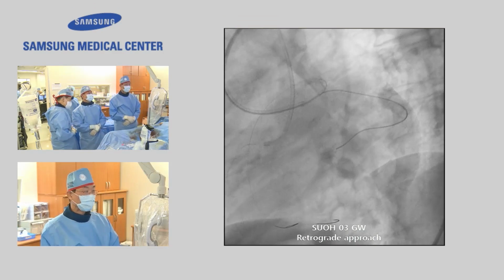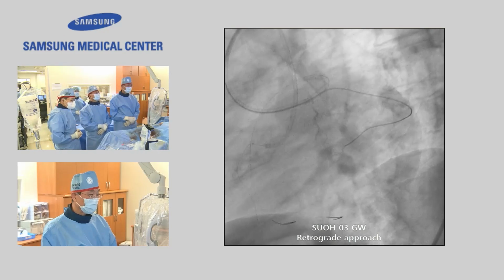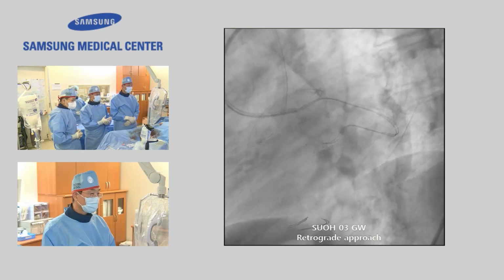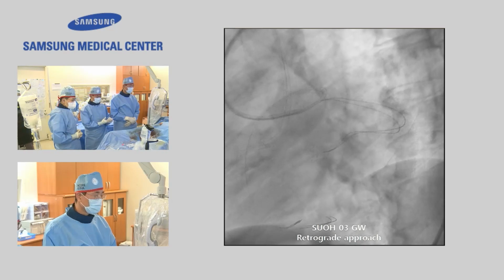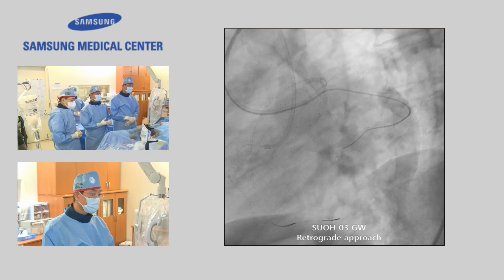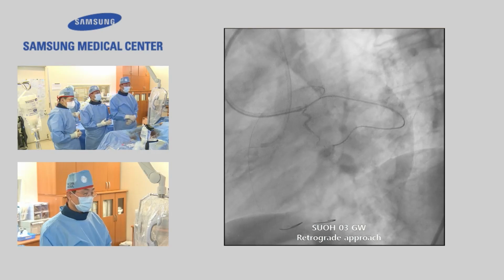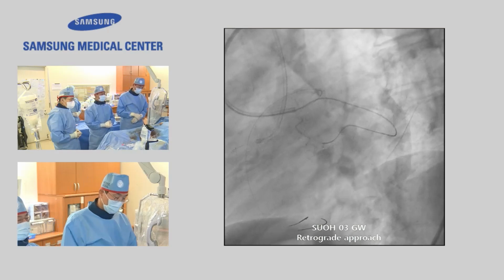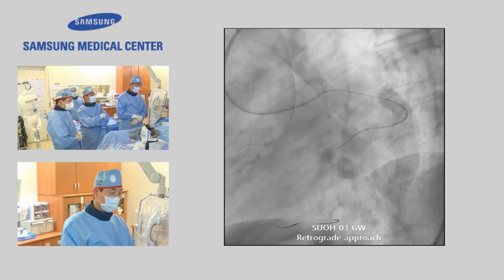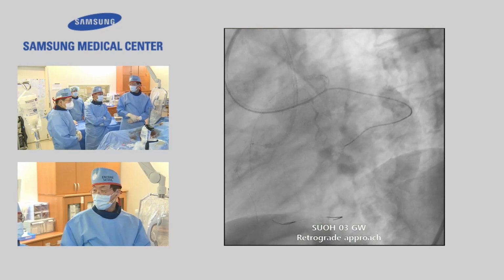Well, actually, I think you can pursue a little bit more, but I recommend using the guiding catheter you're now using for the RCA. Now you don't have any need for it for the LAD channel. So you can remove it, use a second guiding catheter, and then use the retrograde approach from the second guiding catheter. Yeah, right. So if the wire successfully crosses the diagonal to the LAD, we change the right coronary guiding catheter to another XB for left, and we finish the work.